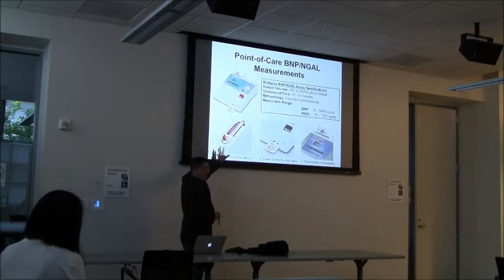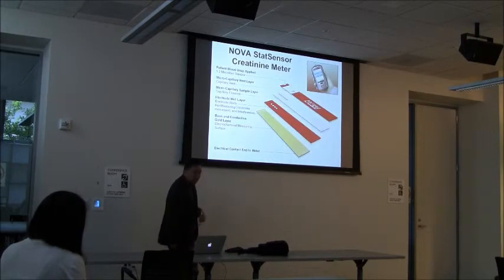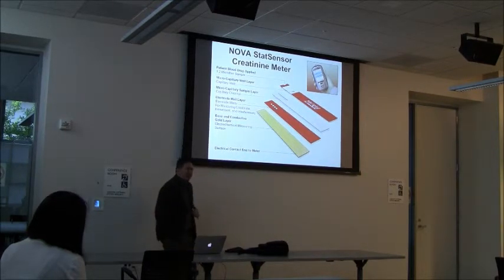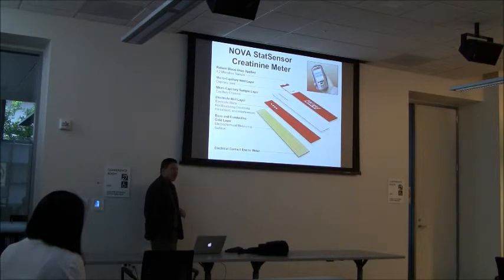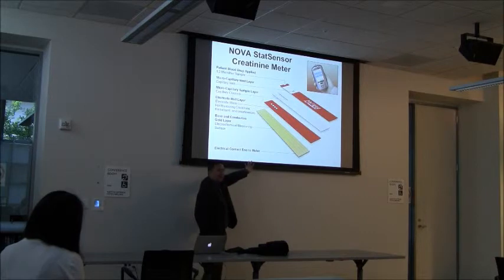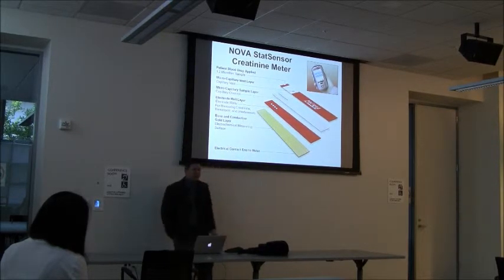But for point-of-care devices, if you ever want to go into industry and start thinking about how much to charge for it, for these types of tests, it's usually about $30. For these little point-of-care handheld disposable strips, it's probably between 50 cents to $1 per strip, and that gets a little bit pricey. But then when you talk about hospitals acquiring these, it becomes volume-based negotiation. So University of California overall, so UCSF, UC Davis, we have a Roche-based glucose meter, and they've negotiated the price down considerably because the whole UC system orders tons of these.